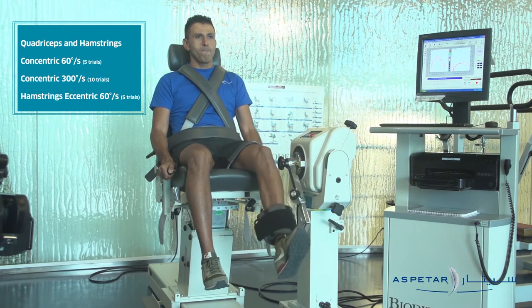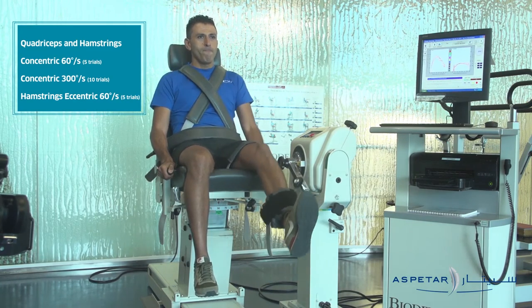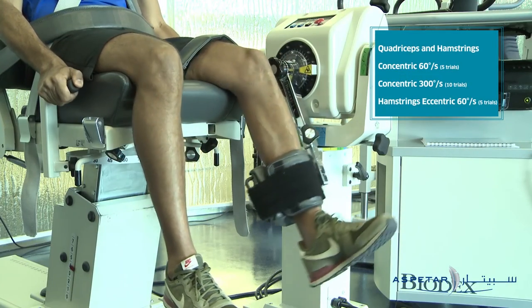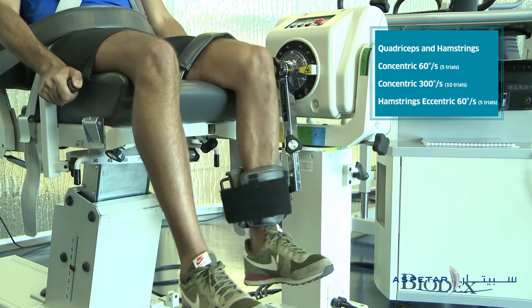Gravitational correction is performed at 30 degrees of knee flexion. During the test, the patient is given vigorous verbal encouragement to exert maximal force throughout.